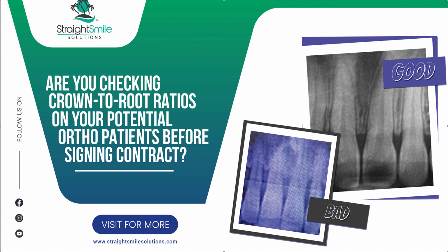A lot of you are starting cases, especially on adults, and you're not considering the crown to root ratio. So let's talk about crown to root ratio, because I talk about that a lot when I review cases with you one-on-one. There are good crown to root ratios, and then there are bad crown to root ratios. Ideally, I want to see at least 50% of the entire tooth being in bone, which we've got here, right?